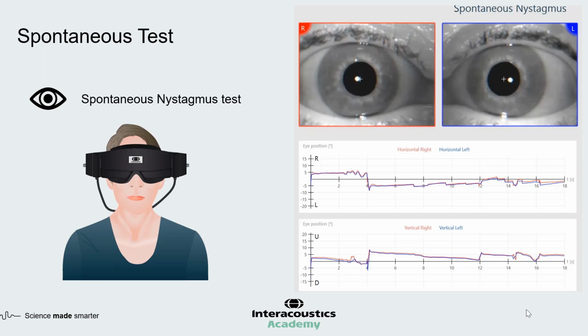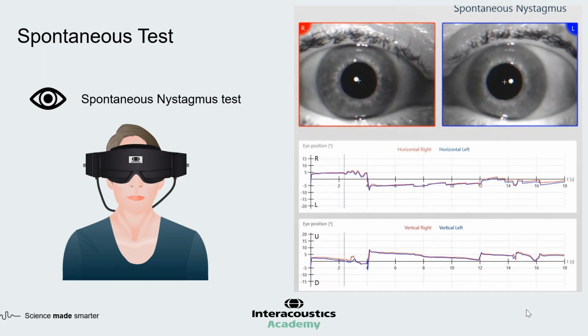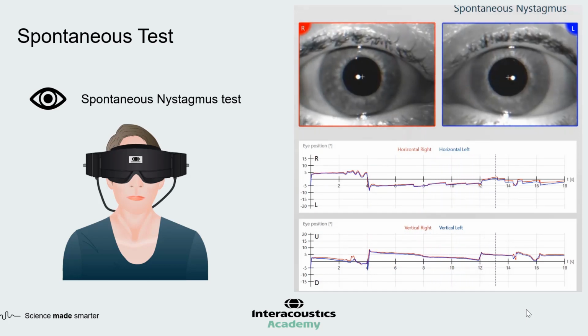They'd have to be less than half a degree, so they're really insignificant. If we watch the video, her eyes look quite steady, right? So I'm not seeing any red flags for spontaneous nystagmus here.